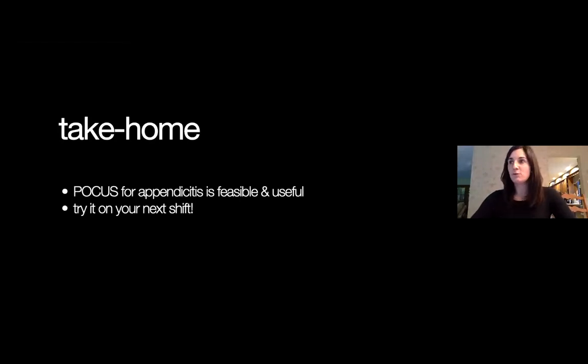Not the one you're going to be looking for like 15 minutes. You don't have that much time. The other thing is think of it as just part of an evaluation, an extension of your physical examination. Again, you always have to have a question for your ultrasound. Pain in the right lower quadrant, let's look to see if there's an appendix. And then sometimes you will find an alternate diagnosis. That's going to be very useful for you in your practice and your flow.